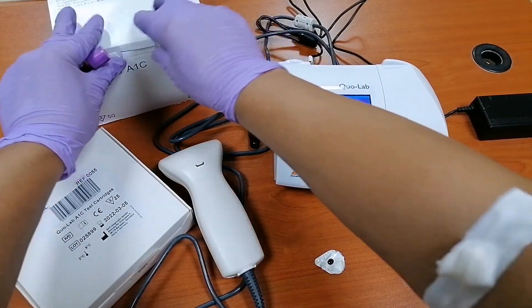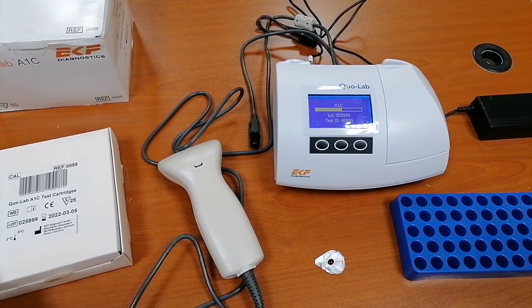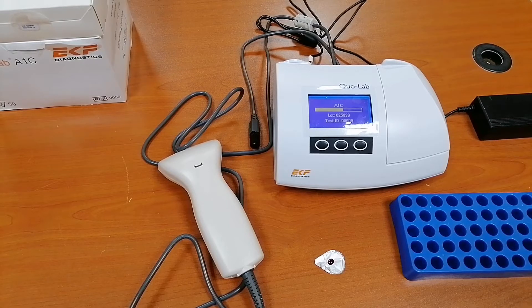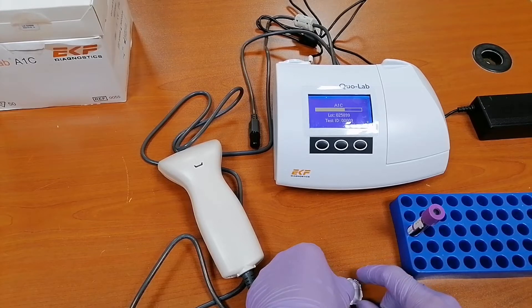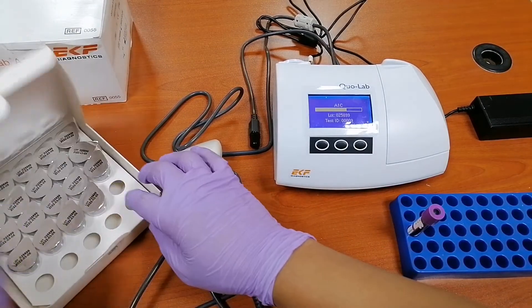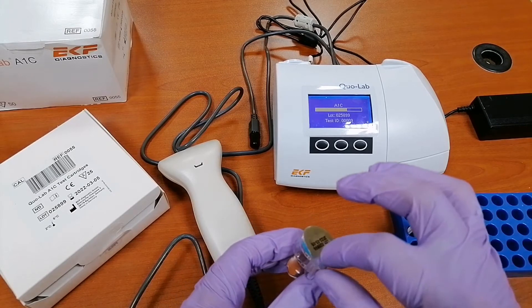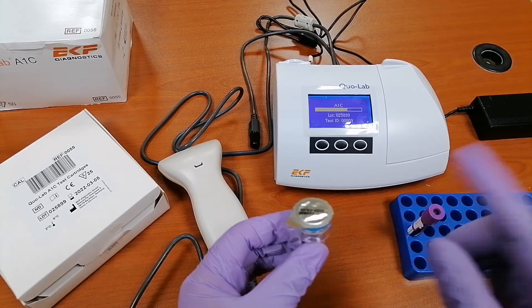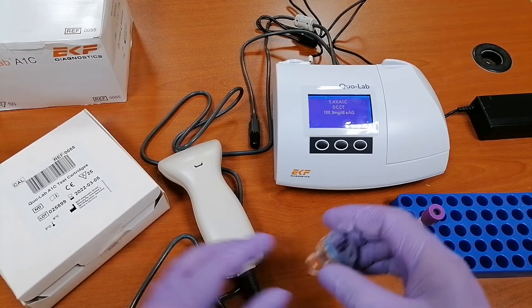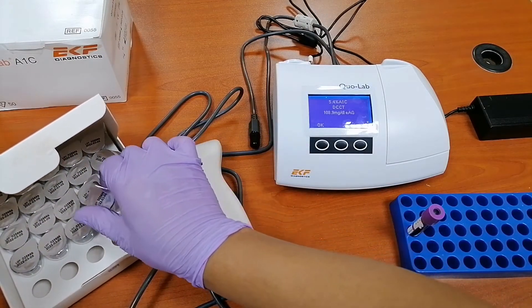So we will wait for the result. I hope my result is normal — and definitely it should be normal because I don't have any history of high sugar. I also want to add: this cartridge, once you already remove the foil, should be used within one minute only. If it exceeds one minute, the cartridge should not be used. Also be careful of the beads or the ball inside.